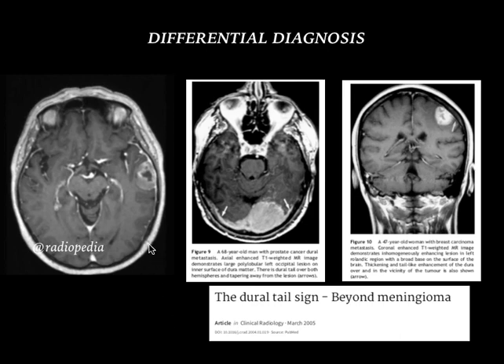Here is the first case taken from Radiopaedia, which is an intra-axial lesion showing heterogeneous enhancement with a central necrotic area and adjacent dural thickening with enhancement. This was a proven case of IDH wild-type glioblastoma.